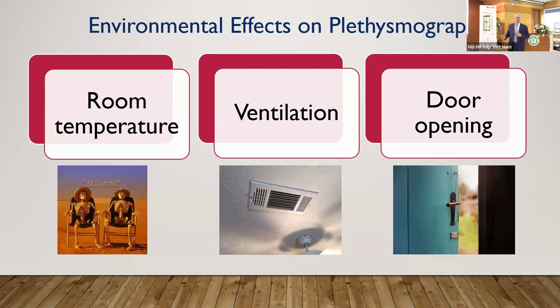The same with if it's in a closed room with a door and you're in the middle of a test or in the middle of a calibration and someone opens that door while you're doing the test, it affects the pressure of the room, it'll affect the pressure of the box.